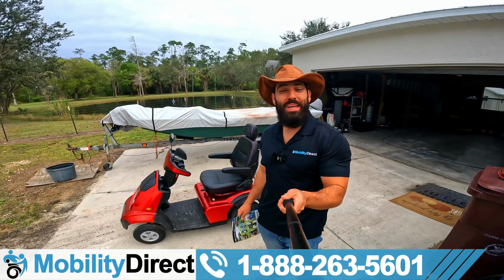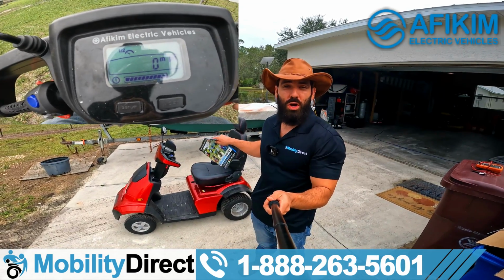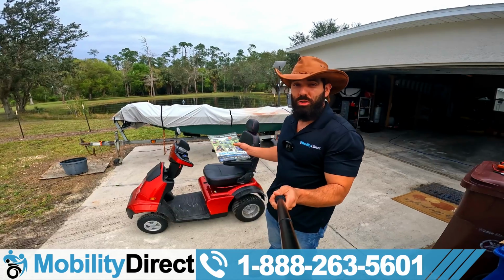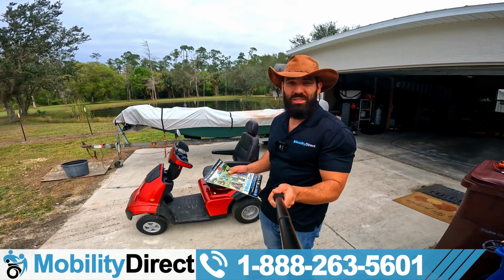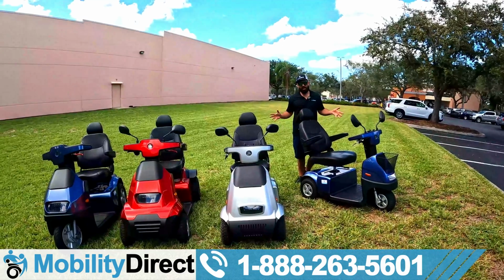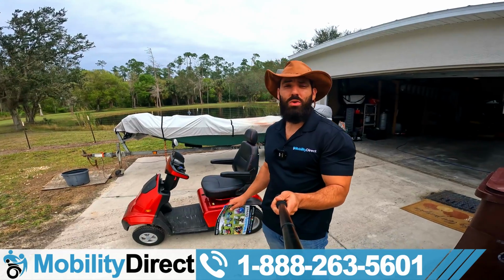Thanks for stopping by. In today's video, we're gonna troubleshoot the error 1 code on the Afikim model S4. Now this video is gonna show you how to troubleshoot the S4 specifically, but you can apply these same troubleshooting tips to the S3 model or the C4 or the C3 or even the SE model. They're all gonna pretty much work the same way with respects to error code number 1.